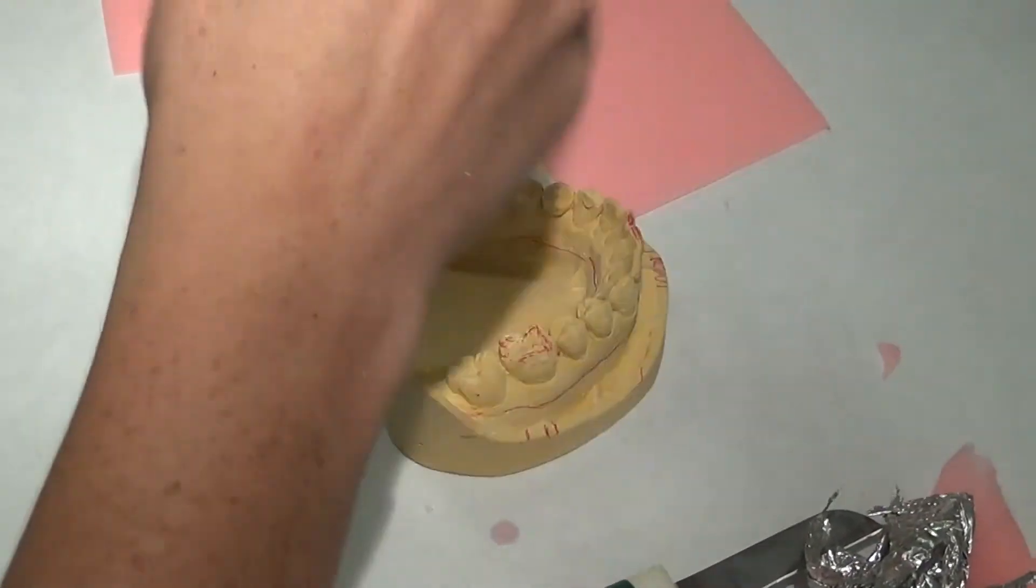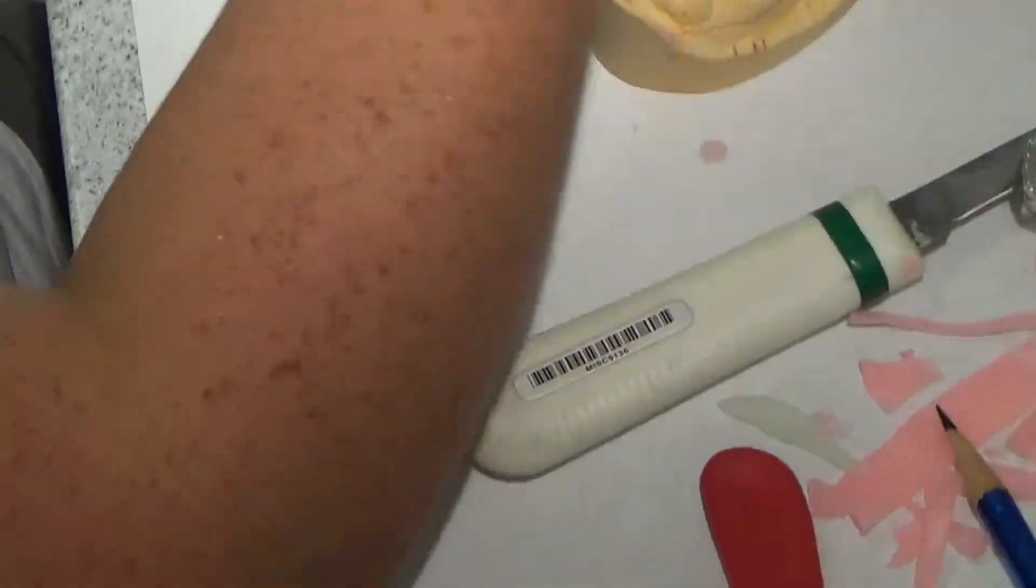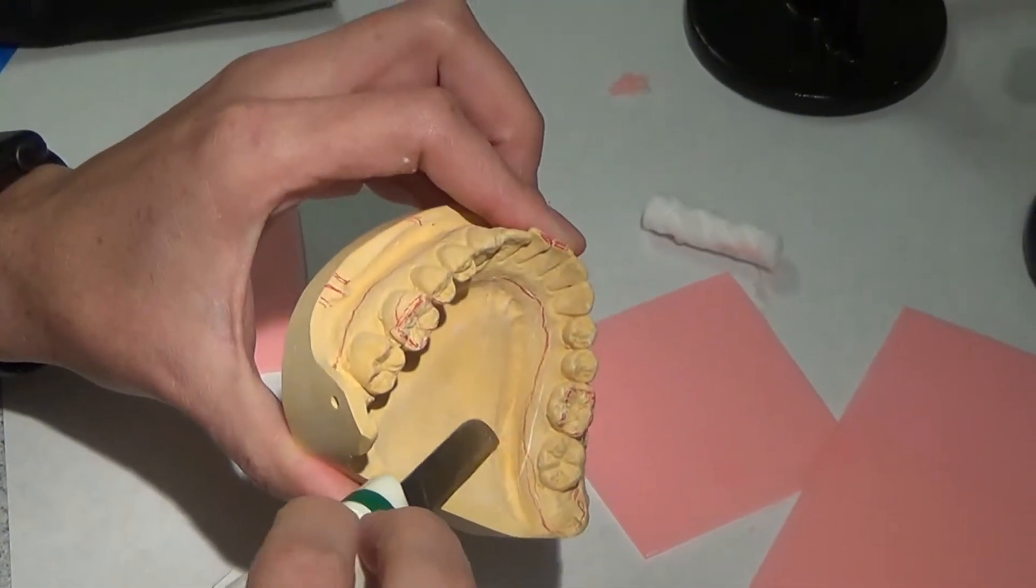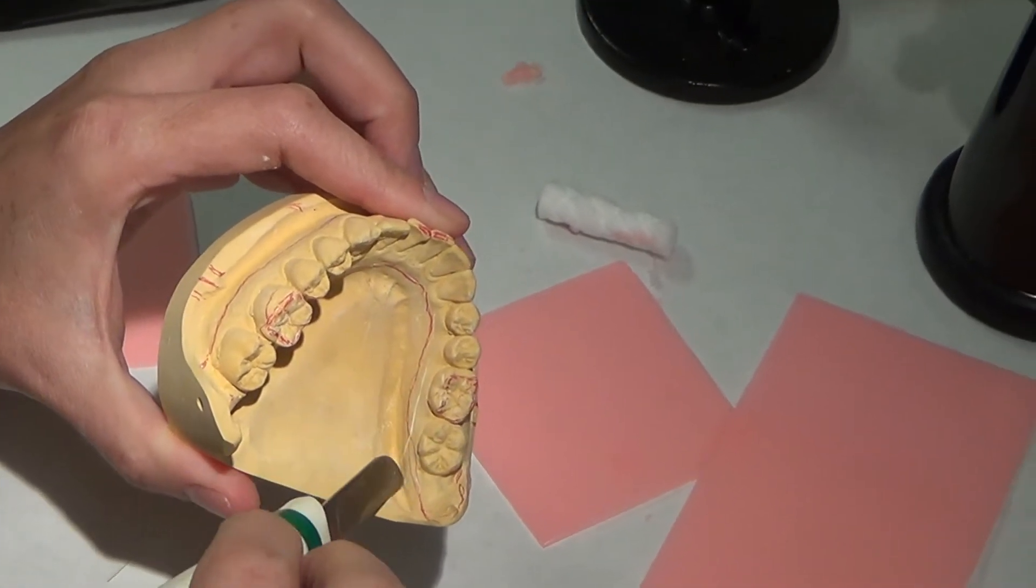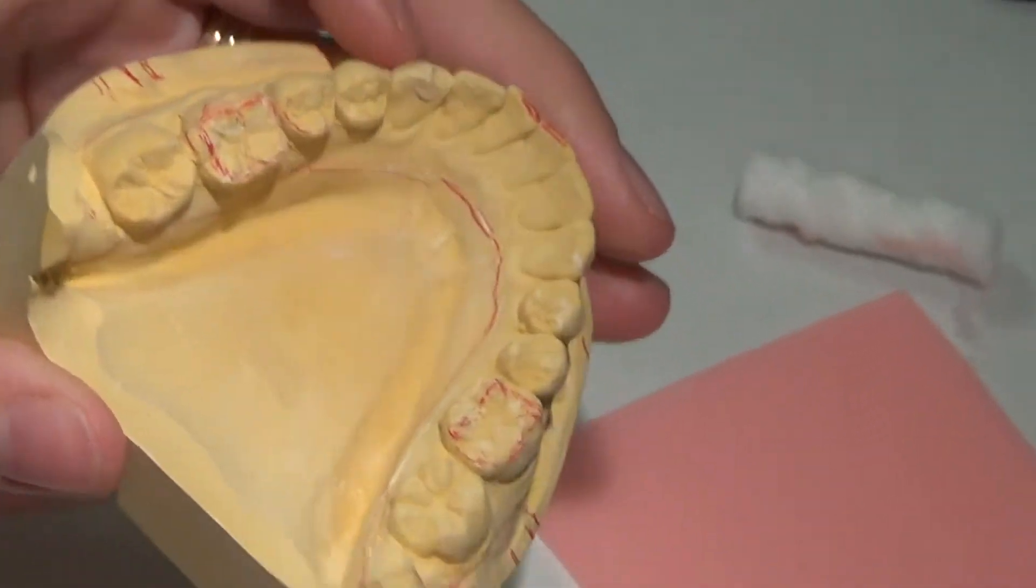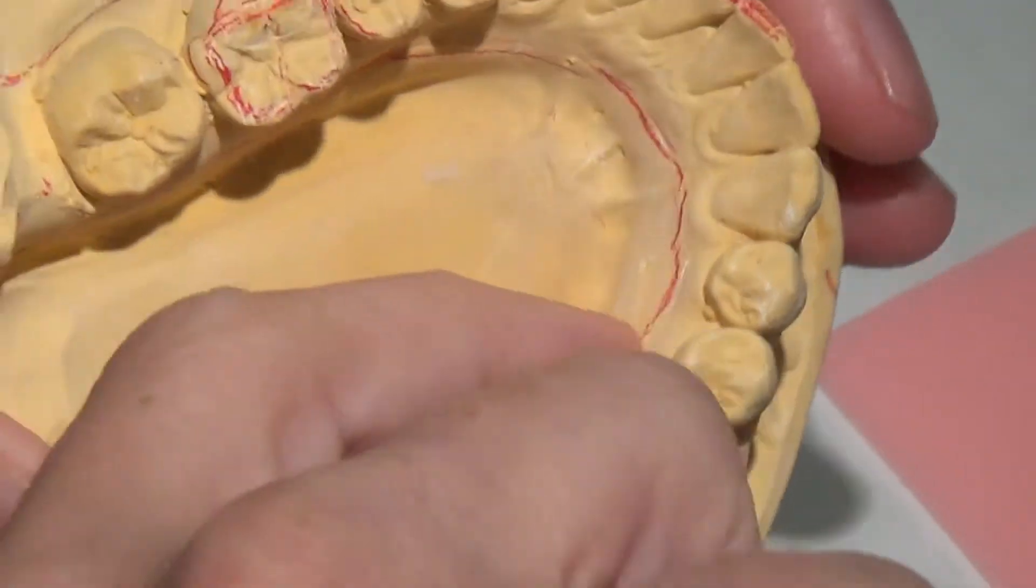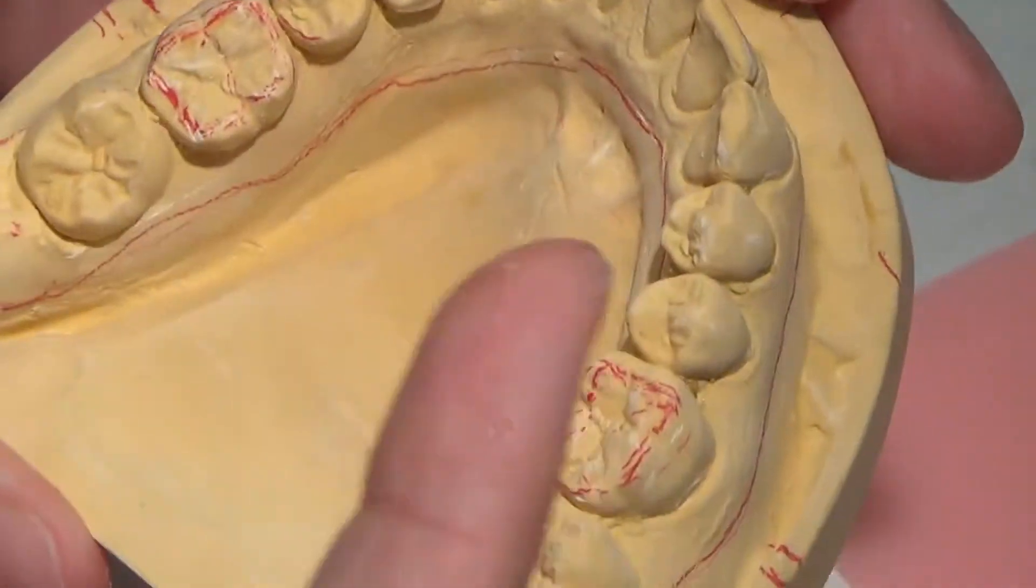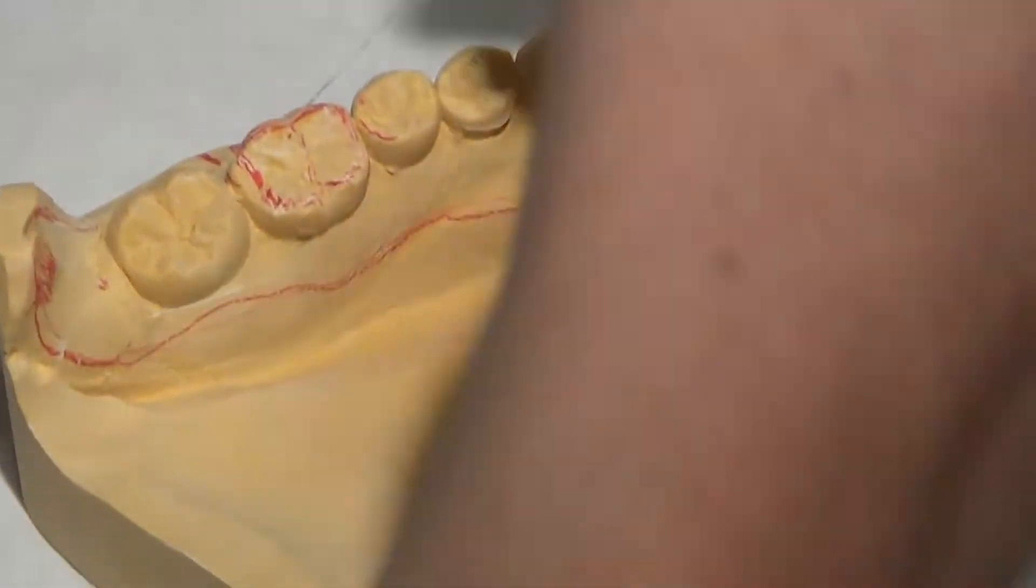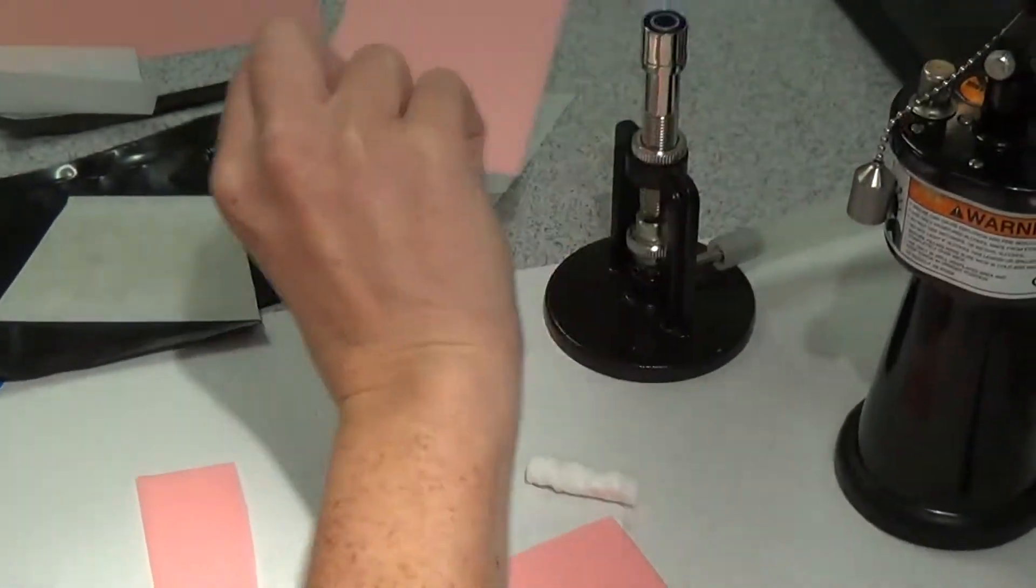Okay, so on the mandible you're going to have the same thing. If you've got undercuts back here, a lot of you guys have undercuts in the retromylohyoid area, so you want to block those out first. If you have tori, especially large ones—I saw someone in this lab had a large one—you want to tuck that wax up underneath there. I don't really have that issue here, so we can help you.